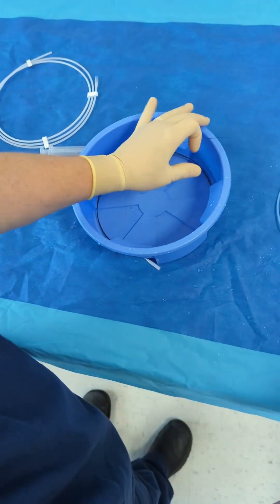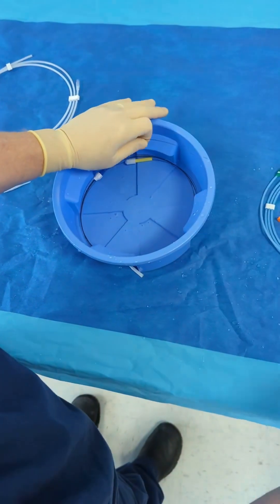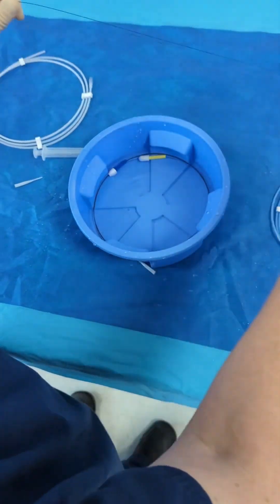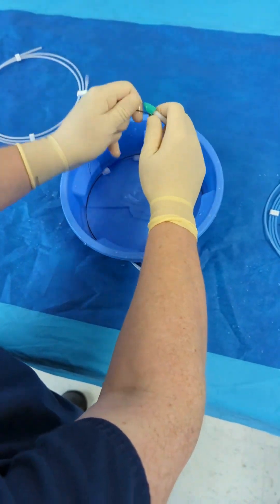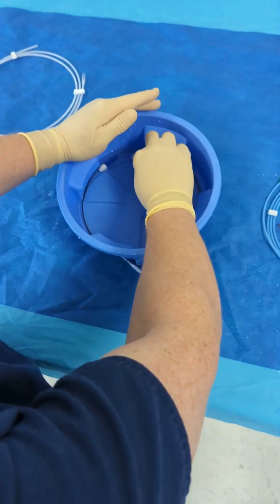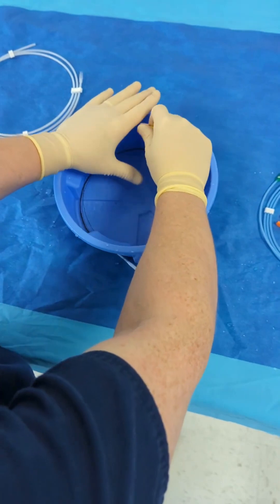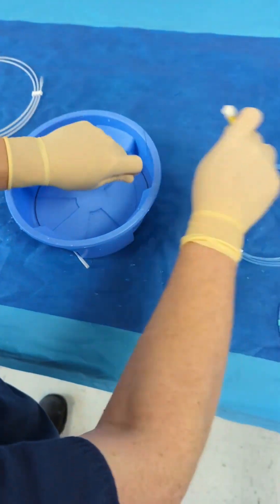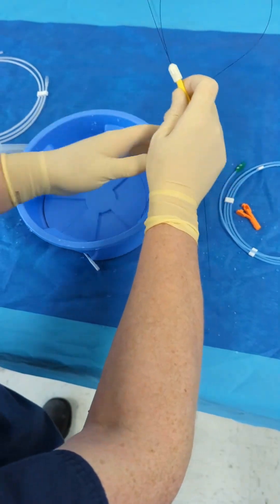And now if any wire pops up while I got this hand, I've got it managed down here. So let's see if I can grab the bottom wire, which I know is the Meister, and see if my other wires pop out. So I grab the torque, I've got my C, and if another wire pops, I've got it managed like that.